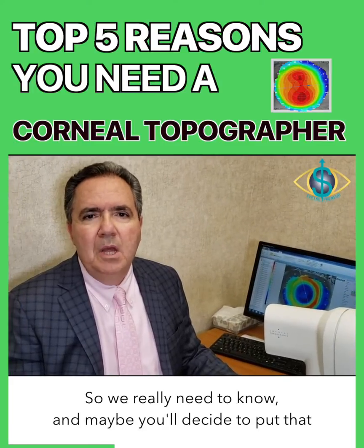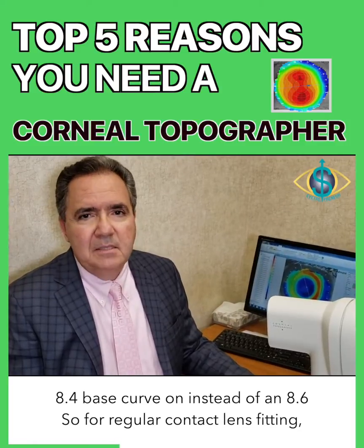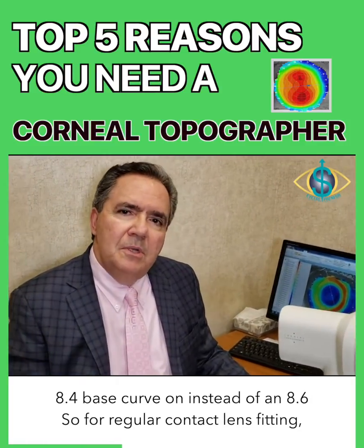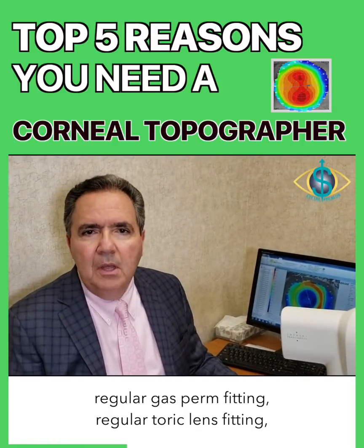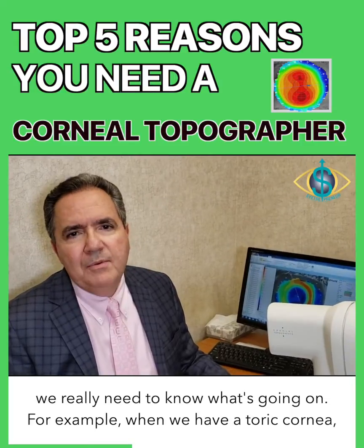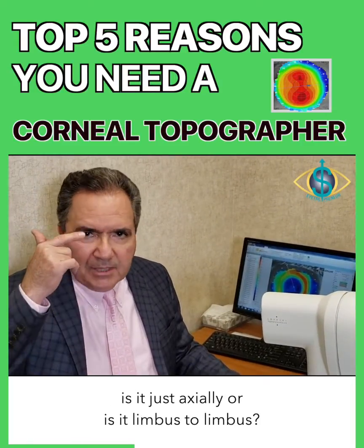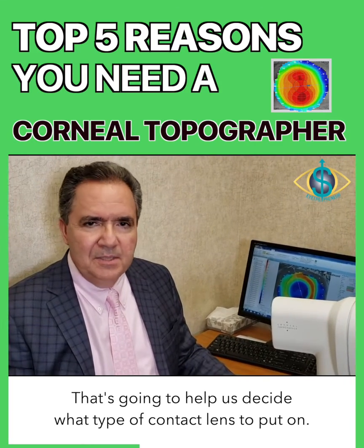So we really need to know, and maybe you'll decide to put that 8.4 base curve on instead of an 8.6. So for regular contact lens fitting, regular gas perm fitting, regular toric lens fitting, we really need to know what's going on. For example, when we have a toric cornea, is it just axial, or is it limbus to limbus? That's going to help us decide what type of contact lens to put on.